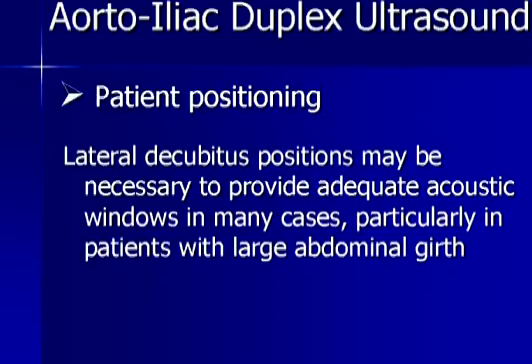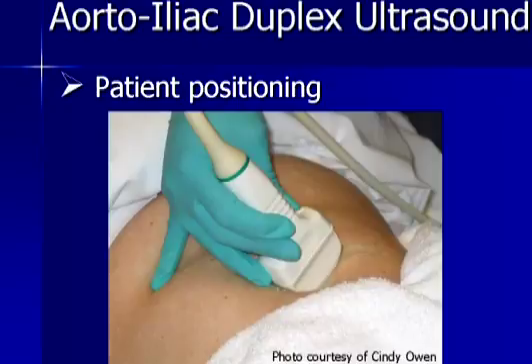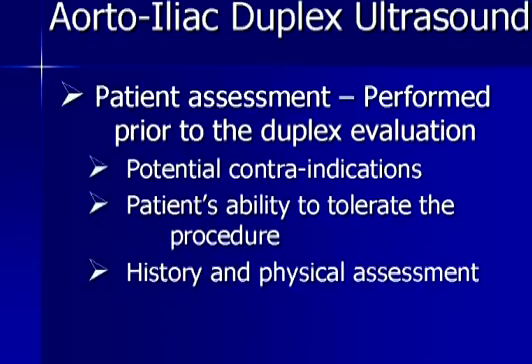and you will need to go to the lateral decubitus positions, such as is seen here, when you roll the patient up onto their side, either the left side or the right side, or in my experience, in most examinations, you're going to be doing it on both sides, looking for that best acoustic window to penetrate down to the level of the aorta, and particularly the iliac arteries.